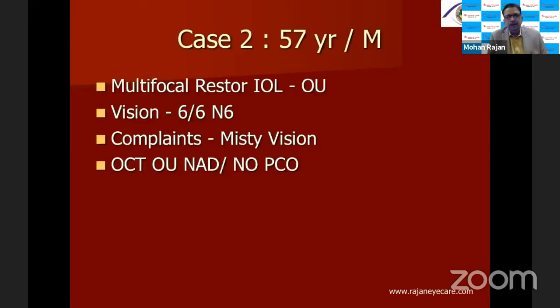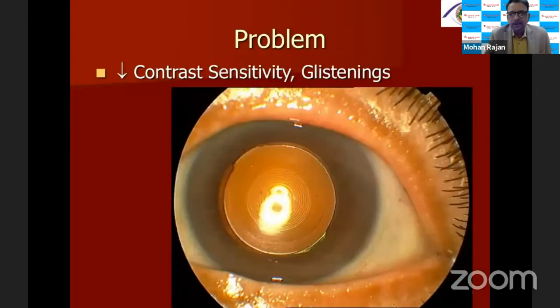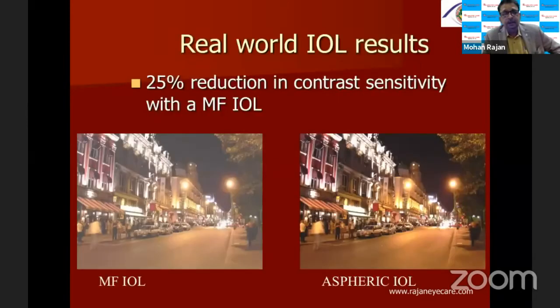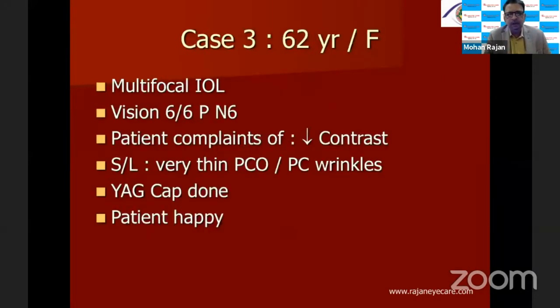Again, a multifocal lens. These patients are complaining of misty vision. You can see here, this is because of the glistenings on the surface of the lens, which is causing this problem. These glistenings can reduce the contrast sensitivity. It is very common with the Acrysof lenses, not with the other lenses. The glistenings decrease the contrast sensitivity and also the night vision, especially for multifocal patients. There is already a 25% reduction in contrast sensitivity with multifocal lenses.